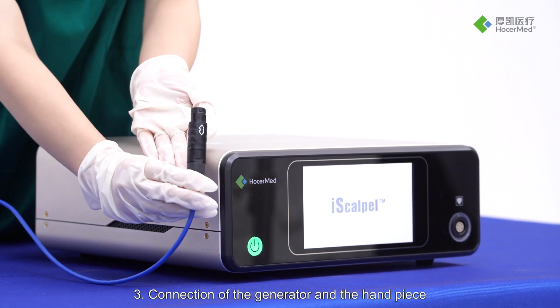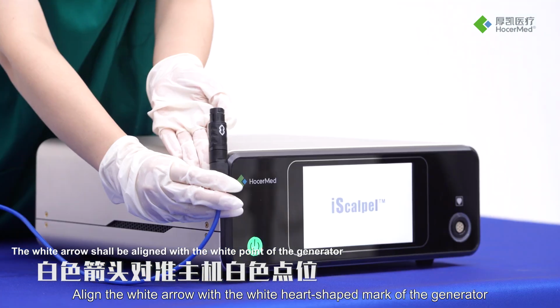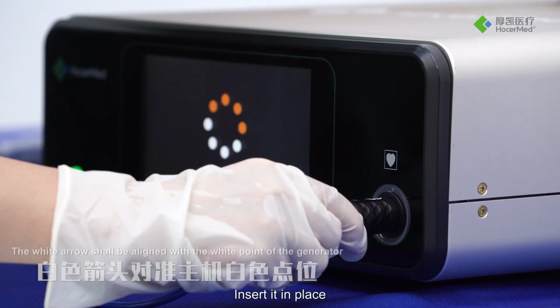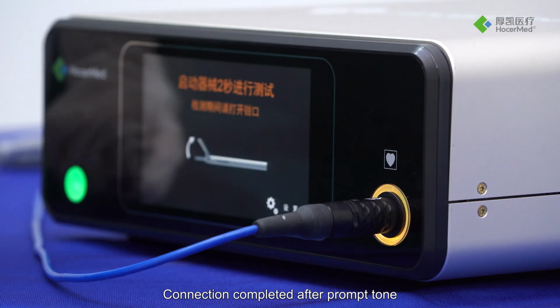3. Connection of the generator and the handpiece. Align the white arrow with the white heart-shaped mark of the generator. Insert it in place. Connection completed after prompt tone.